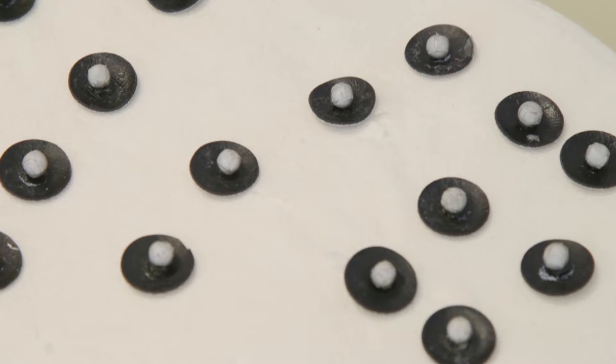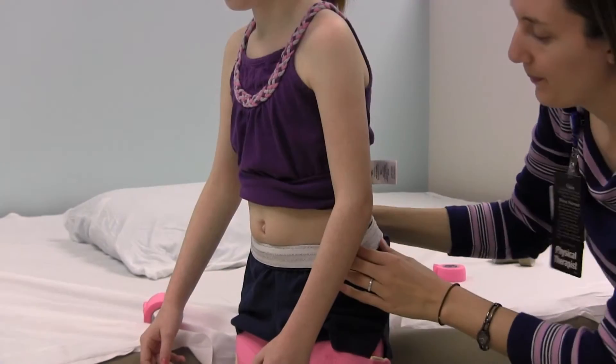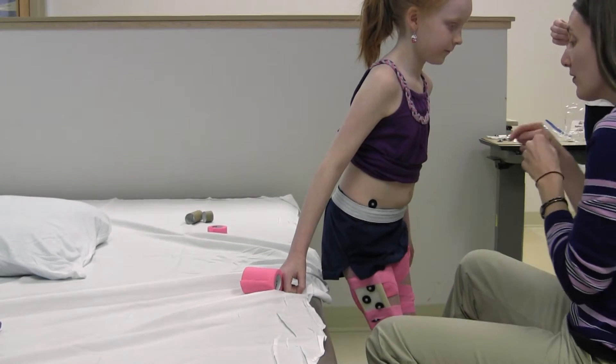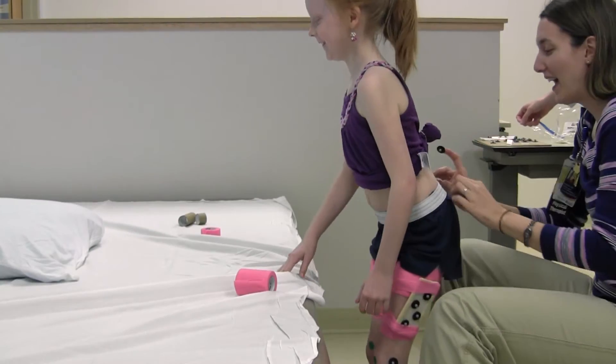Once the PT has put the stickers on me, she will help me to stand up. I will have to roll my shirt up so the PT can see my belly button and hips. Then she will put the stickers on my hips and on my back. These will not hurt. I will have to leave my shirt rolled up until my appointment is finished.